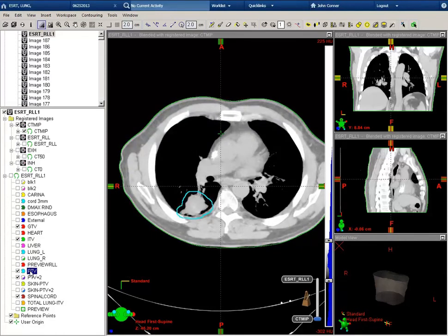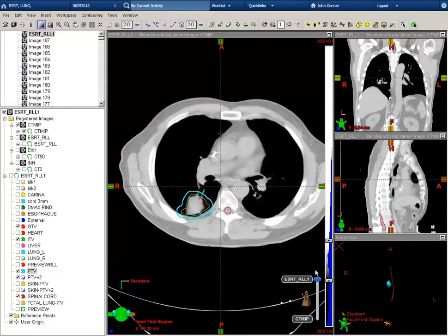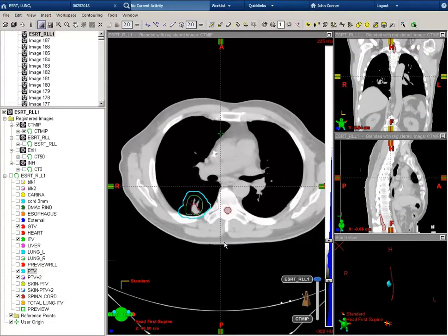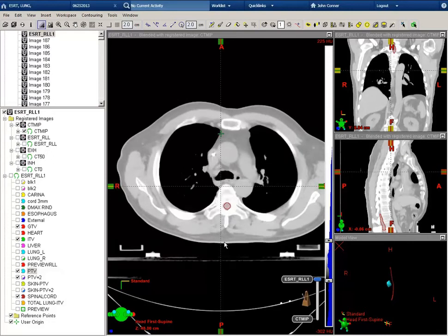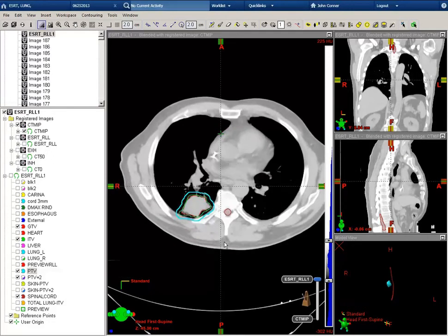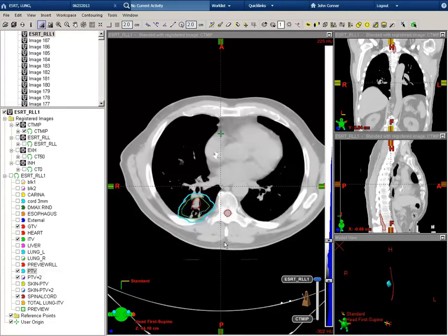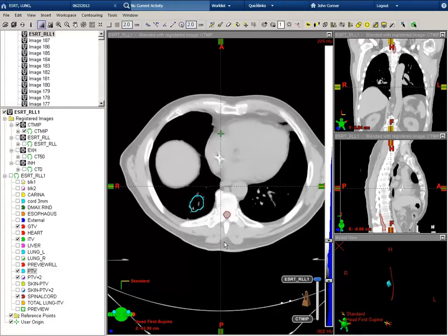I will then show you the PTV. Let's go back to the free breathing CT. You can see the PTV is 5 mm around the ITV. This PTV accounts for all motion of this target volume.